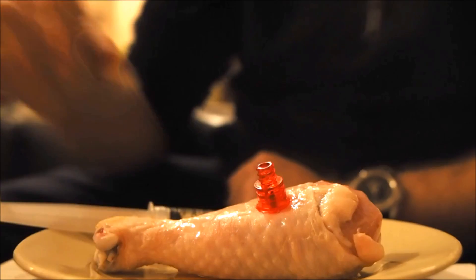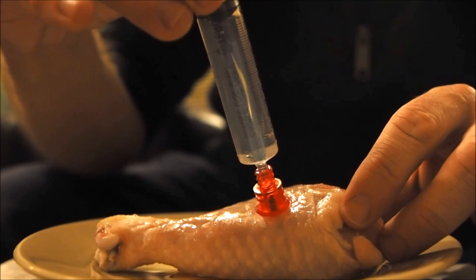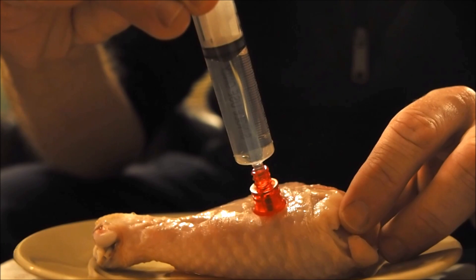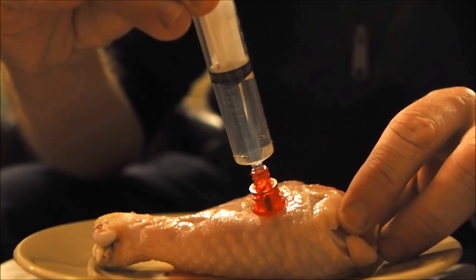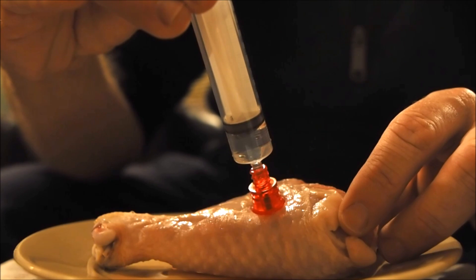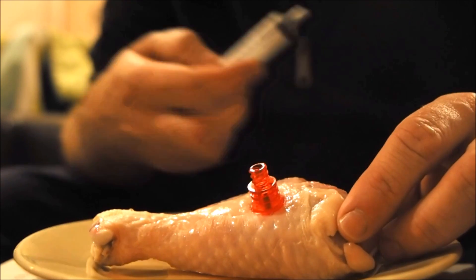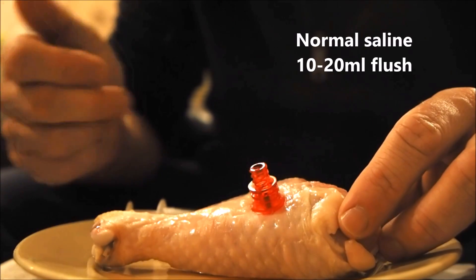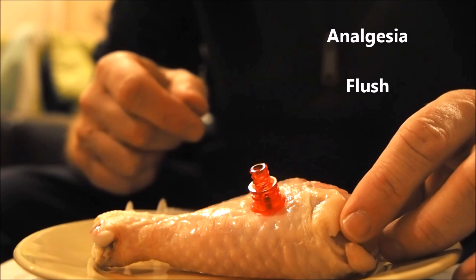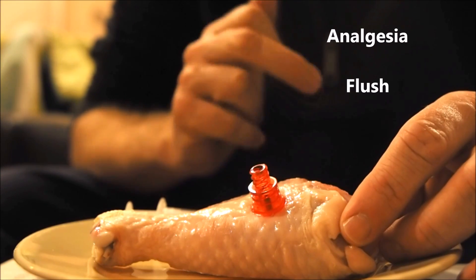After you've given pain relief — or if your patient is not conscious — you can go straight ahead, attach a syringe with some normal saline, and push through a good flush dose. You will feel a bit of resistance, but it actually becomes easier the more you push. Essentially what you're doing is reducing the viscosity inside the bone so that any future use, the IV will flow quite well. In a human patient, you'd probably want to go for about 10ml at the least, maybe even up to 20ml. So: pain relief if your patient's conscious, 1% lignocaine, and a good decent flush before you connect whatever tubing you're going to use.